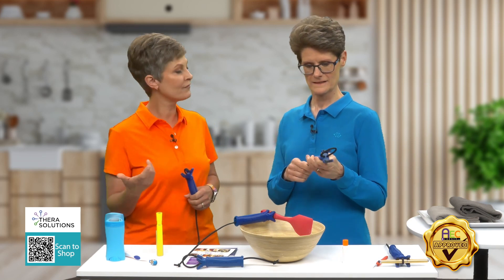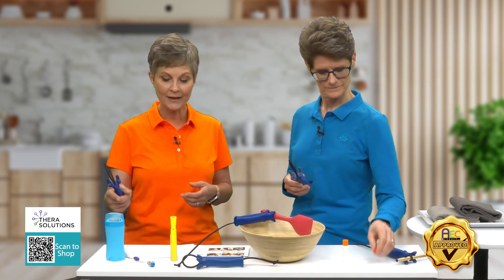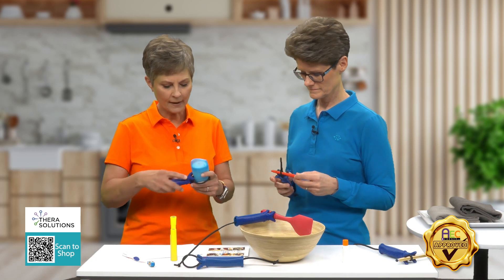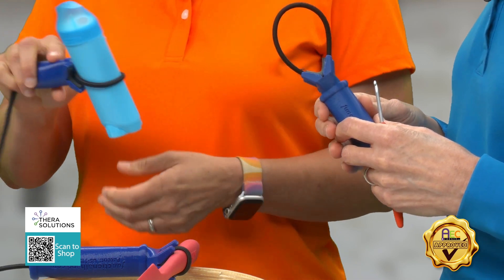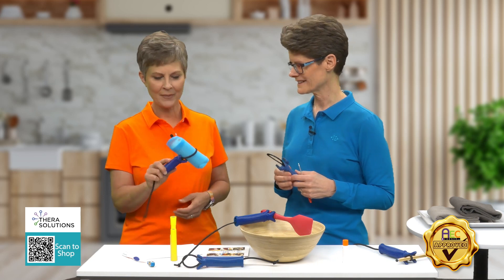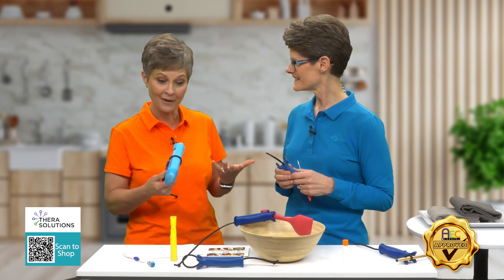Now let's see how to use the Functional Hand. One of the things I tried it on was actually using a deodorant stick. I put it in there and tightened it up, and interestingly, it kind of went this way on me. But look how well that fits — it was a happy accident. It helps extend that reach if you're putting on deodorant, so that worked well.